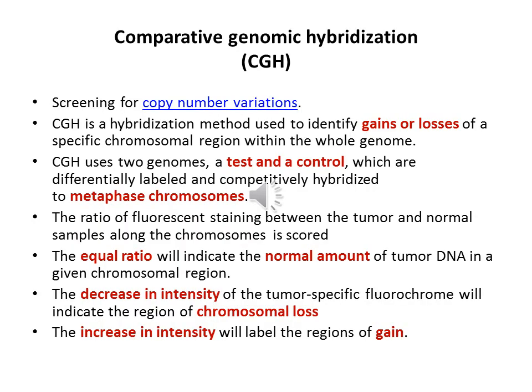Comparative genomic hybridization is a technique that allows the detection of chromosomal copy number change without the need for cell culturing. It provides a global overview of chromosomal gains and losses throughout the whole genome of the impaired cell. Routinely, sample DNA is labeled with green and normal reference DNA is labeled with red, and they are mixed in the same ratio and hybridized to normal human metaphase chromosome spread, which is located on the slide. The green and red labeled DNA fragments compete for hybridization to their locus of origin on the chromosomes. The normal reference DNA and the metaphase chromosome are obtained from a healthy volunteer.